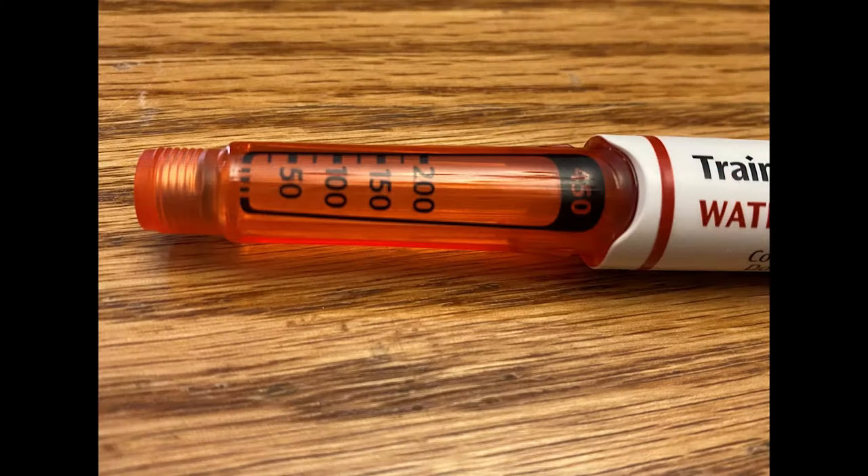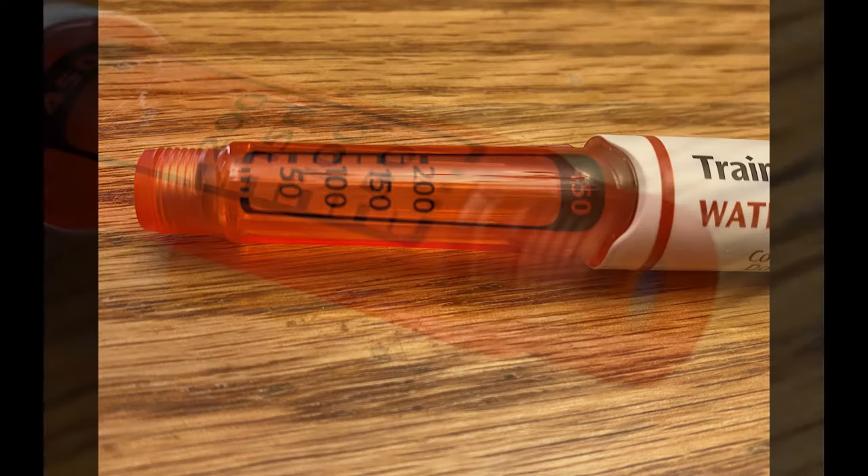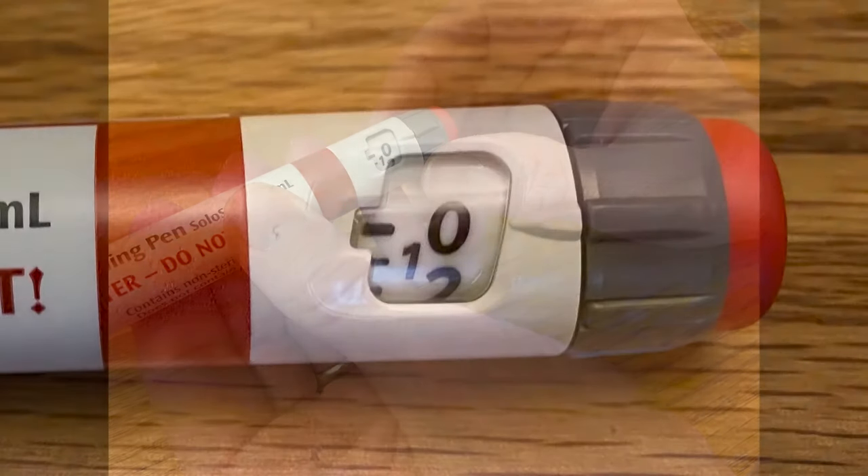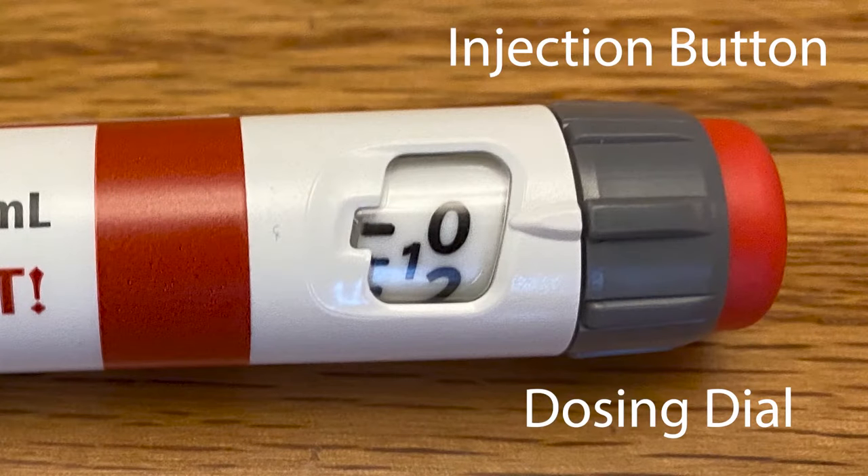There is an insulin reservoir, which contains all the insulin. There is a rubber stopper, which is where you will attach the insulin pen needle. There is a dosing window, which shows you how many units you've selected. And next to the dosing window is a dosing dial and an injection button.